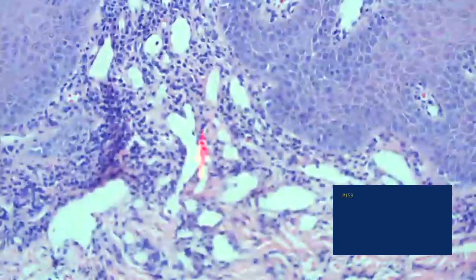Okay. You may get some eosinophils in the infiltrate. You may get some polys. So notice that there are more polys up top than there is infiltrate down in the lamina propria here. So this is candidiasis. I think we have a nice picture of that.